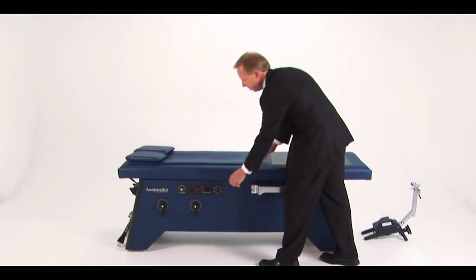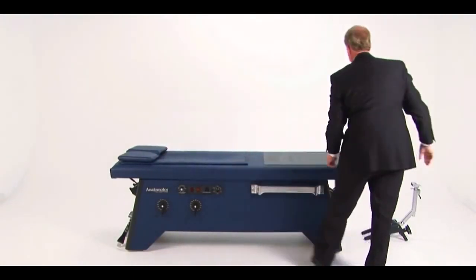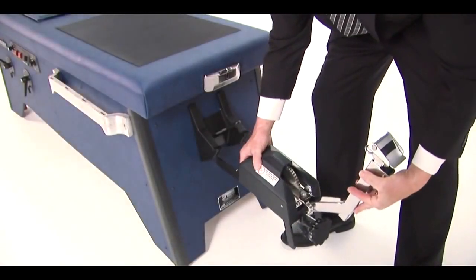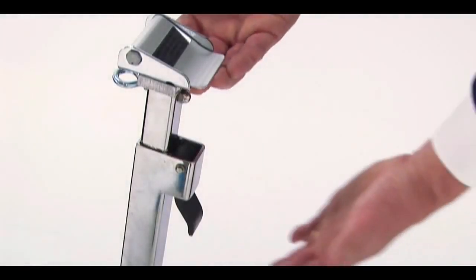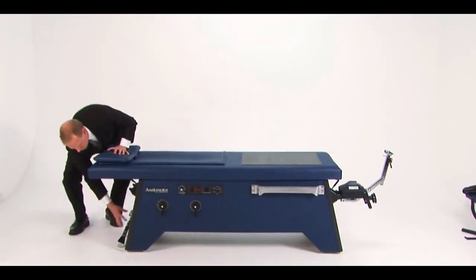The Hill Anatomotor can deliver either intermittent or constant traction. For lumbar traction, first set the table to the cervical position. This allows for easy installation of the traction control unit. Insert the traction unit into the brackets on the base of the table and lower the buckle assembly. The counter traction unit inserts into the bracket at the head end of the table.